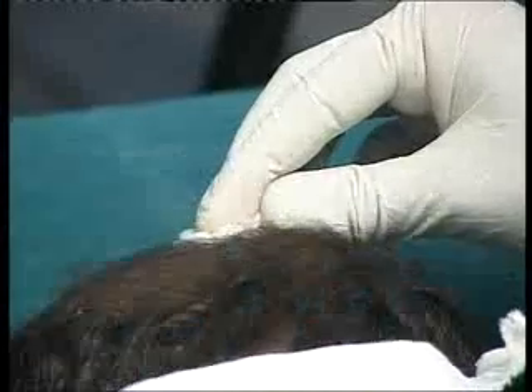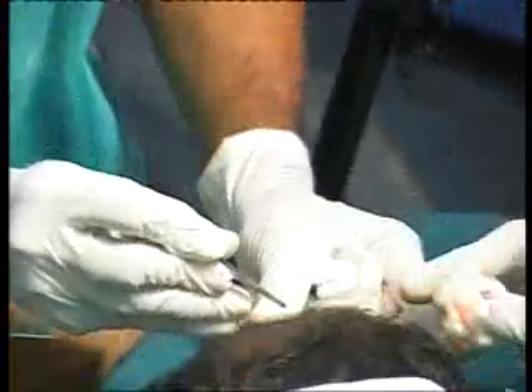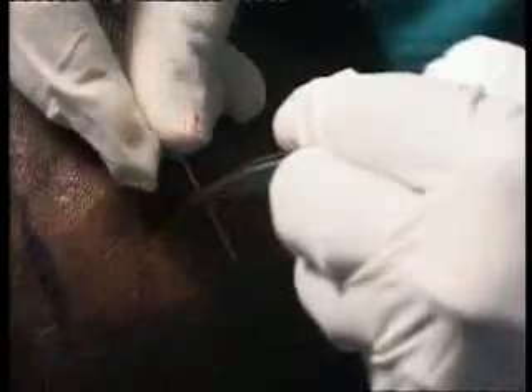It will be very, very simple. See again — again a graft. Catch it like that within the forceps. Just pierce it inside, use a needle, just press it, remove it. That will be simple. This way you can implant around 1000 roots. If you are going to implant 1000 roots, it is going to be cosmetically useful for the patient.